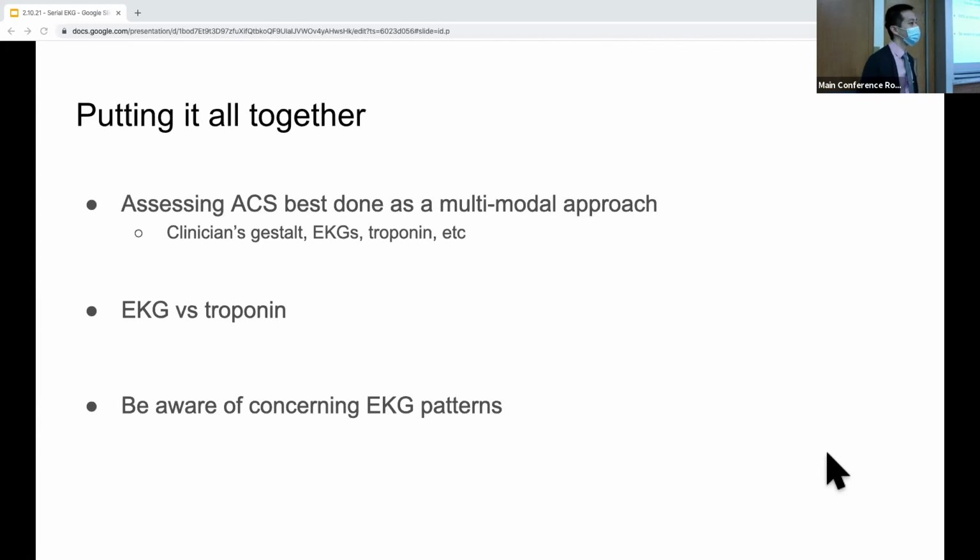The other thing sometimes is, as you also pointed out, getting an old EKG. And unlikely, but I've seen it a couple times, is what's called pseudo-normalization. You have someone that has an EKG that looks okay, but they're having significant chest pain and they have risk factors. And then you get an old EKG and see that before they had T-wave inversions and now they're upright. And you say, wow, there's a change. So both repeating the EKG right away after having ongoing chest pain or getting an old EKG, even if the EKG you have doesn't look too bad, and seeing if there's something new in it.